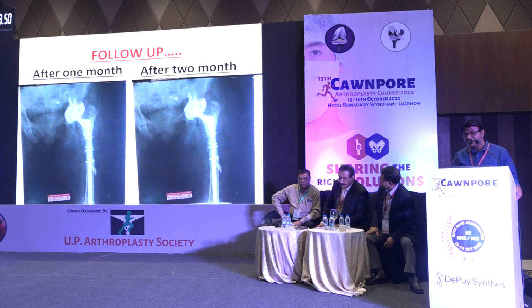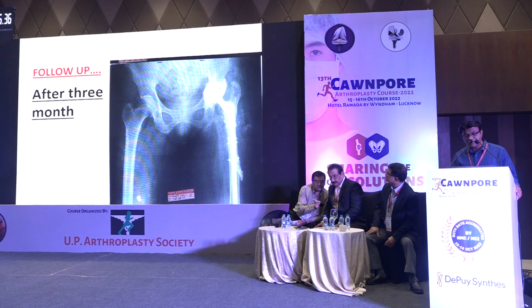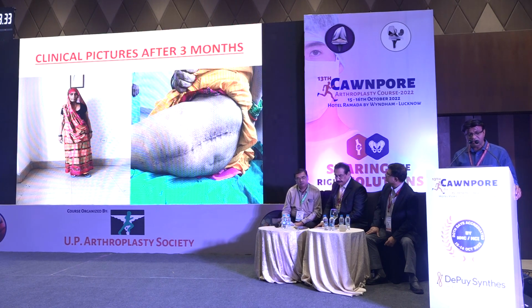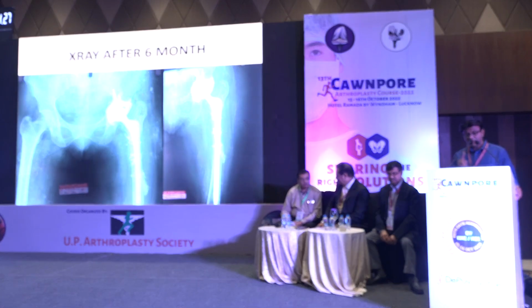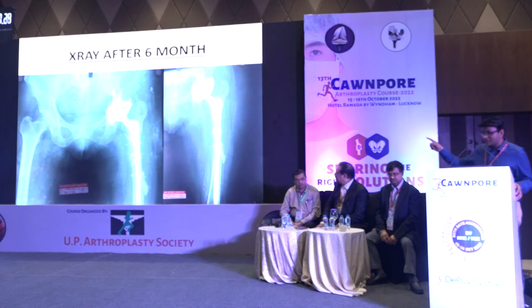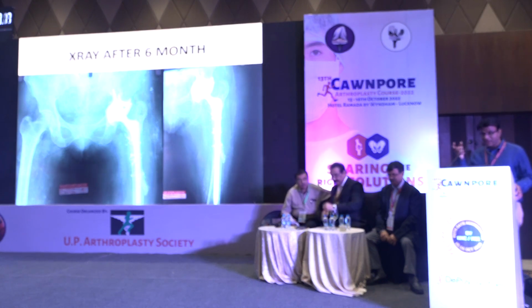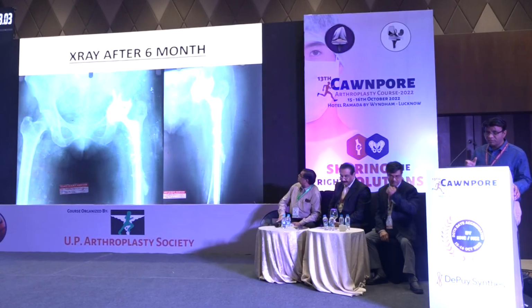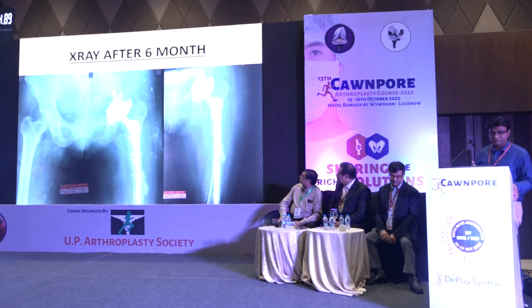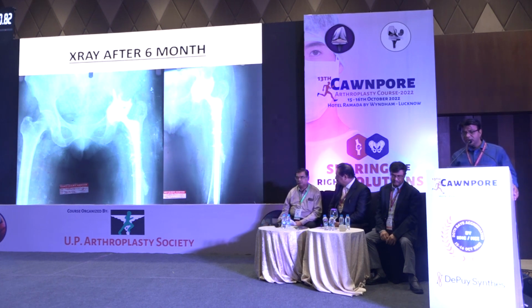This is 1 month, 2 months, and 3 months. And she last visited a few days back, at 6 months follow-up. She was walking without any support. At 6 months follow-up, you can easily see a little bit of cement popping out of the lateral cortex. That was due to the perforation that I had. And immediately I changed my plan to make a window. Especially in osteoporotic patients, I make a rectangular window. I didn't do ETO. So this was the last follow-up, 6 months.